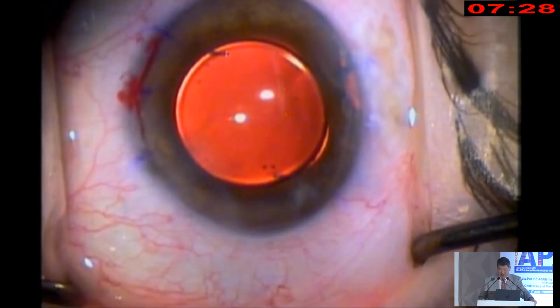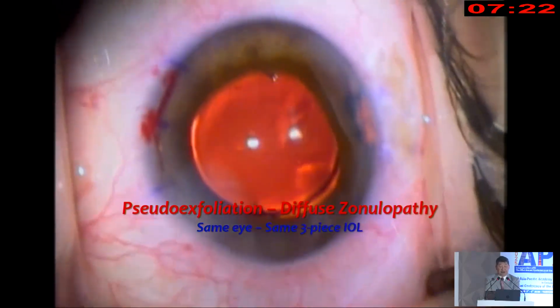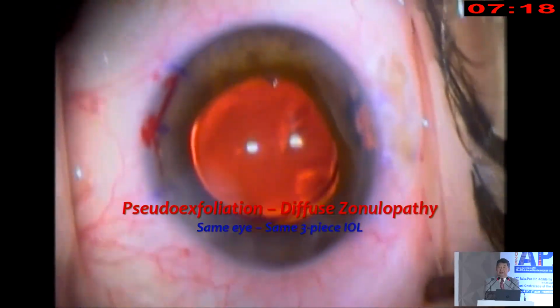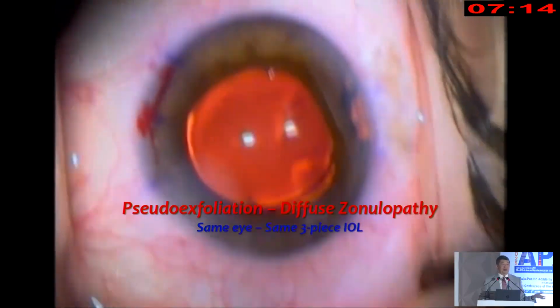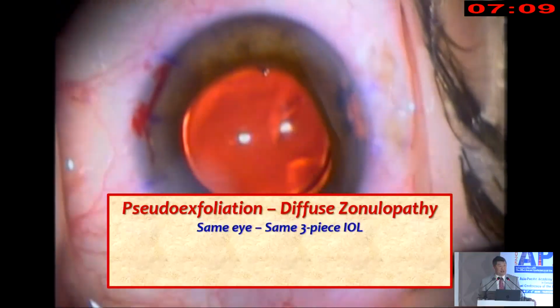That's what usually happens. So okay, so here, jiggle the eye once. So I'm going to jiggle the eye and look what happens. So, wow, this is great. Now, why do I call this my index case? Because this is only one case that I don't have a lot of follow-up. I'm here on the operating table, but this is very unusual.